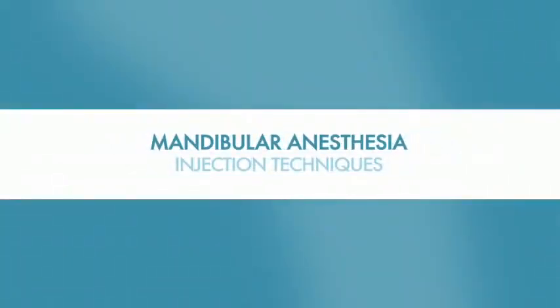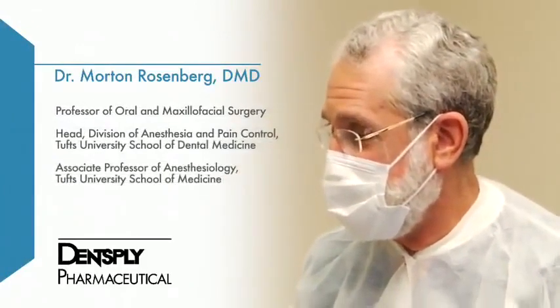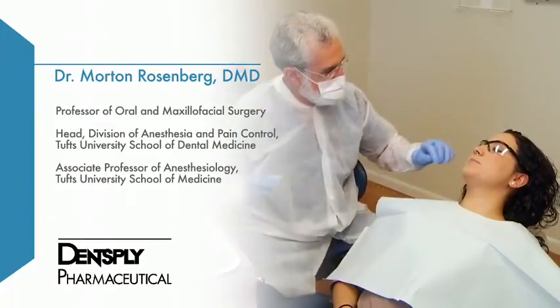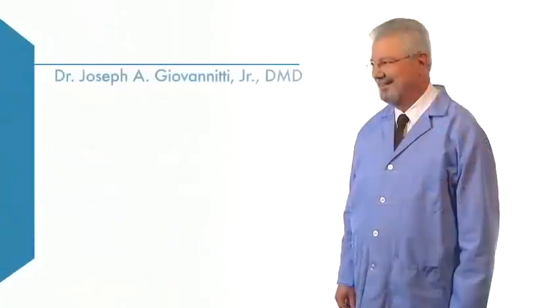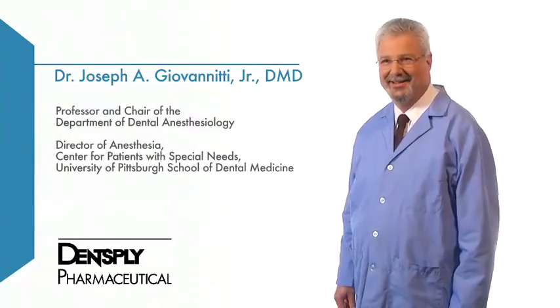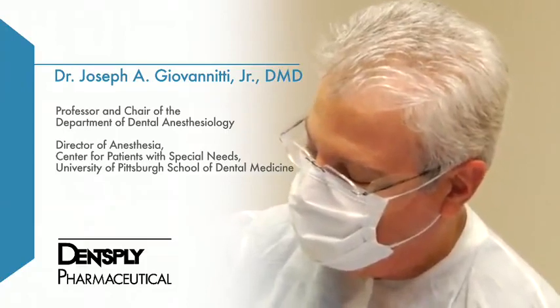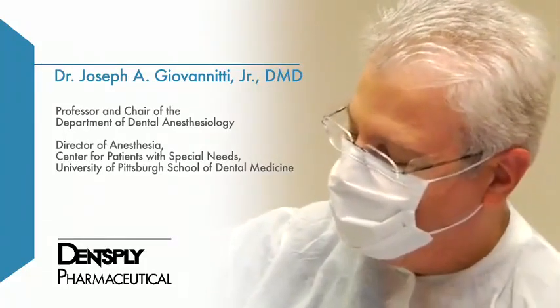Mandibular Anesthesia, Injection Techniques with Dr. Morton Rosenberg, Professor of Oral and Maxillofacial Surgery, Head, Division of Anesthesia and Pain Control, Tufts University School of Dental Medicine, and Associate Professor of Anesthesiology, Tufts University School of Medicine, and Dr. Joseph A. Giovannitti, Jr., Professor and Chair of the Department of Dental Anesthesiology, Director of Anesthesia, Center for Patients with Special Needs, University of Pittsburgh School of Dental Medicine.